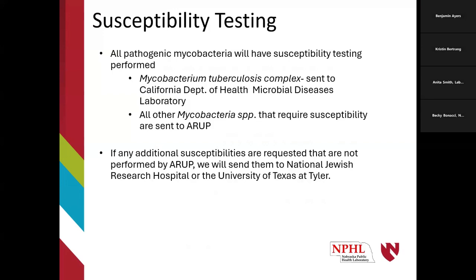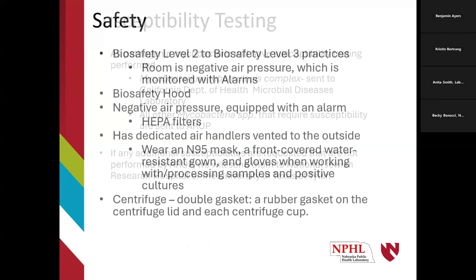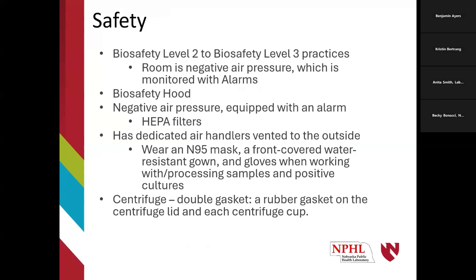This is for safety reasons and just the safety of everyone. So if there are any additional susceptibilities that are required, not performed at ARUP, we can send to National Jewish, and there's University of Texas at Tyler. There are numerous times, especially with rapidly growing mycobacteria such as M. abscessus, that ARUP is unable to do certain antimycobacterial agents.